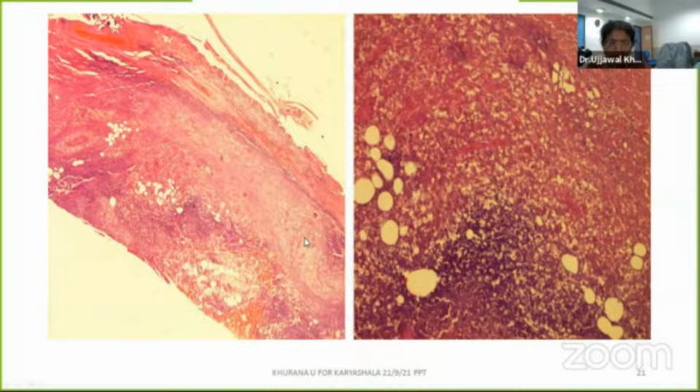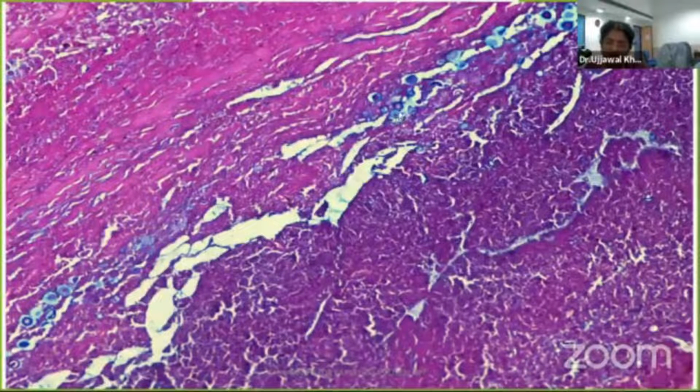I'll show you the slides of the case. Requested for special stains like PAS with Alcian blue. The Alcian blue stains the capsule, and the yeast itself is stained by PAS stain. So this is, and then these are the GMS stains for the patient.